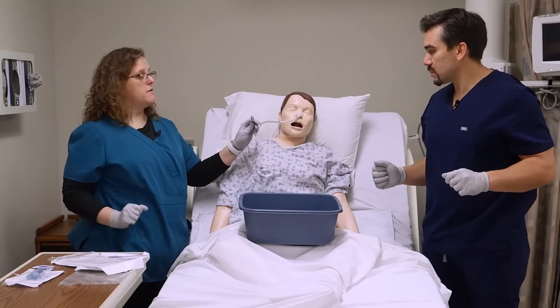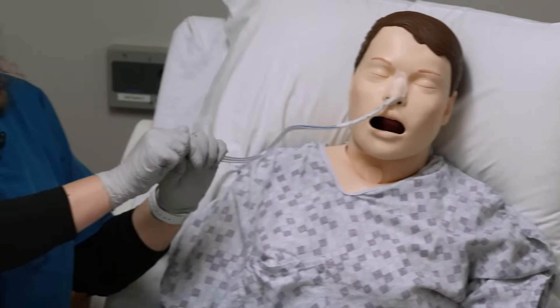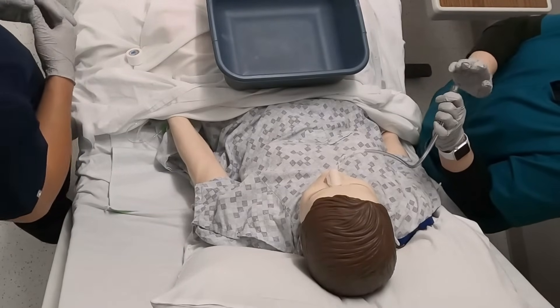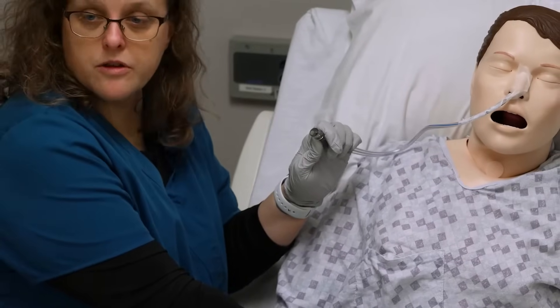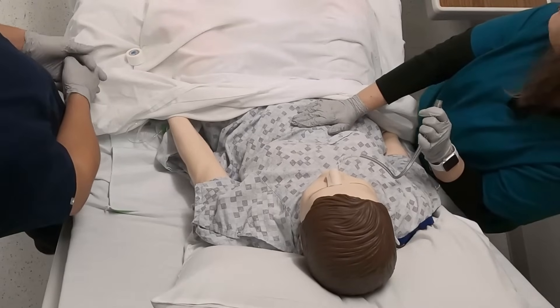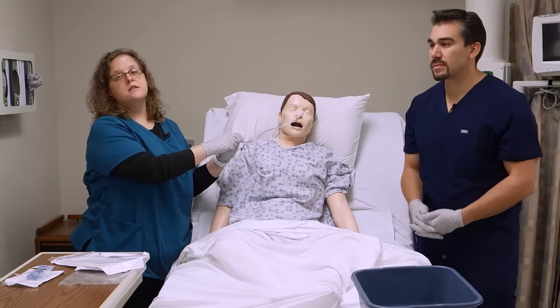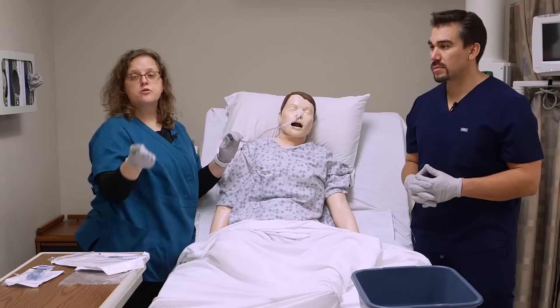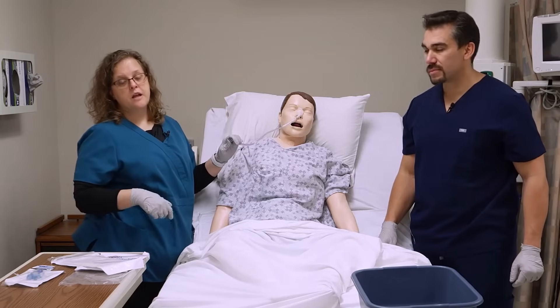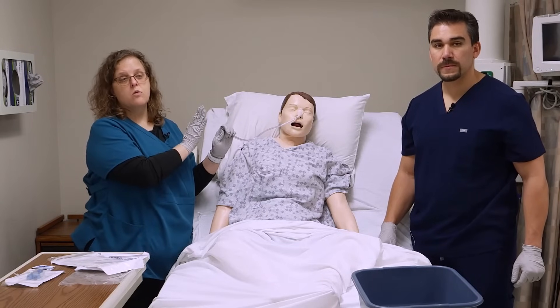At this point, I really want to make sure that the tube is in the right place. Old school is to inject 60 milliliters of air into the port with a really big syringe and then listen with your stethoscope to make sure that you hear a blurp in the stomach. You're welcome to do that, but it's not diagnostic for the tube being in the right place. What you're going to need to do is follow your policies — usually you'll withdraw some gastric acid and put that on pH paper, and/or get an x-ray to make sure that it's in the right spot. Those are absolutely essential steps if you're going to be putting any medicines or fluids in.